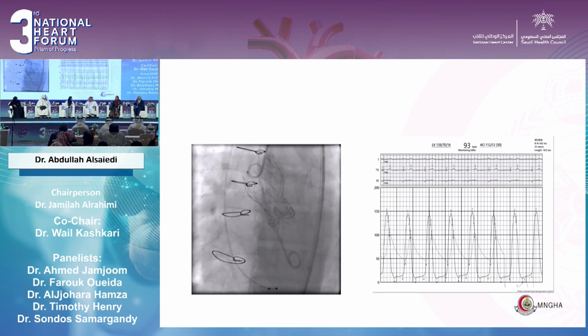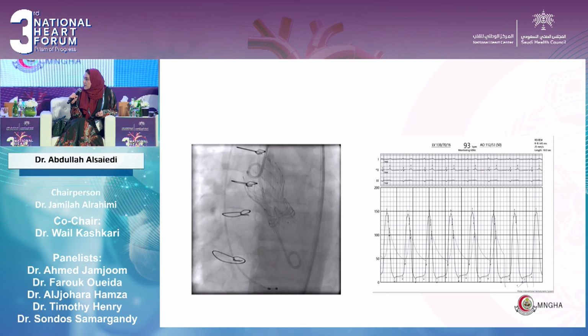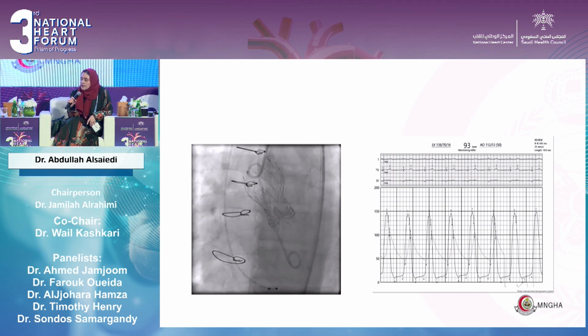Yes, it's working. So in my strategy, the way that Dr. Abdullah has mentioned, I would rather fracture post, because I will have an understanding once the self-expandable valve has been deployed. I would like to do a hemodynamic assessment as a prediction of what's going on. As I can see, there are 2 pigtails. After that, it will help me to consider fracturing or post-dilating, because from here I cannot see how much the valve is expanded, but if it's under-expanded or a bit squeezed, I would go with post-dilatation or maybe fracture, as in this case.